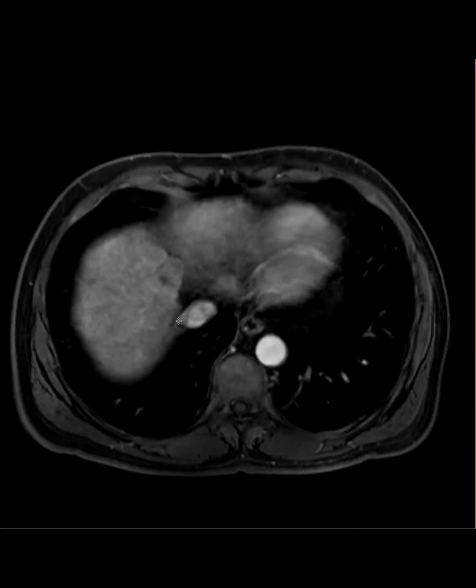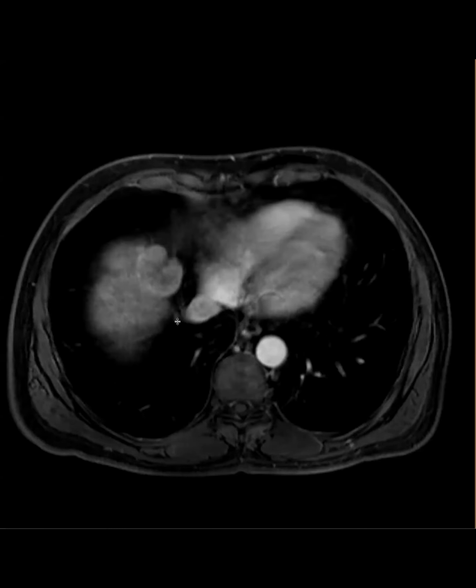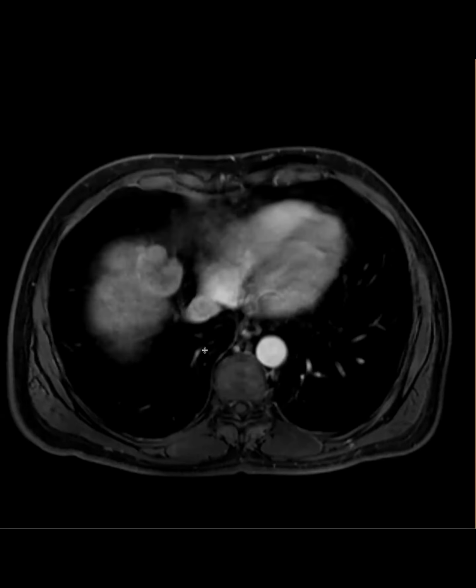But this highlights the importance of the rule: if you're not sure between M and 5, you go with M, because there are tricky tumors which can mimic HCC. This is a great example where the patient received a transplant when, theoretically, they shouldn't have.